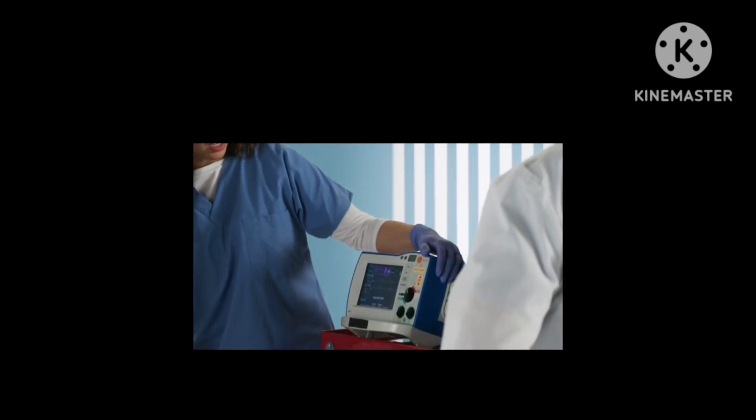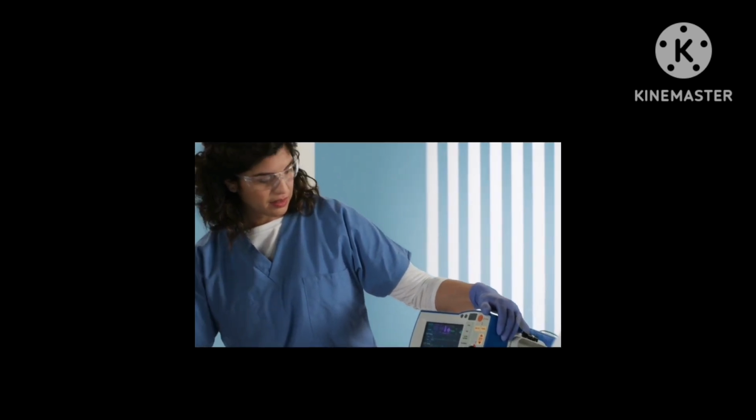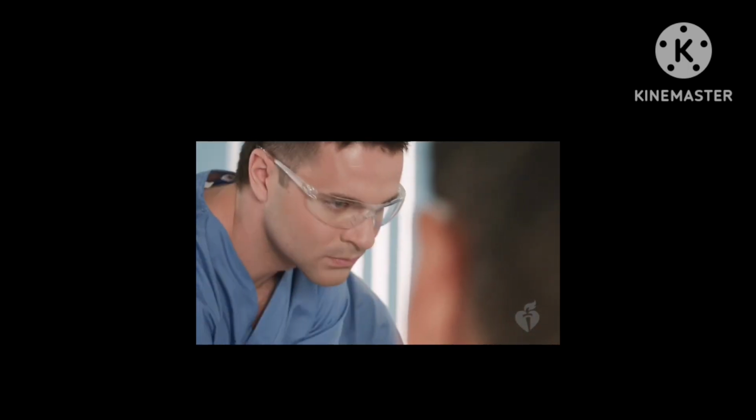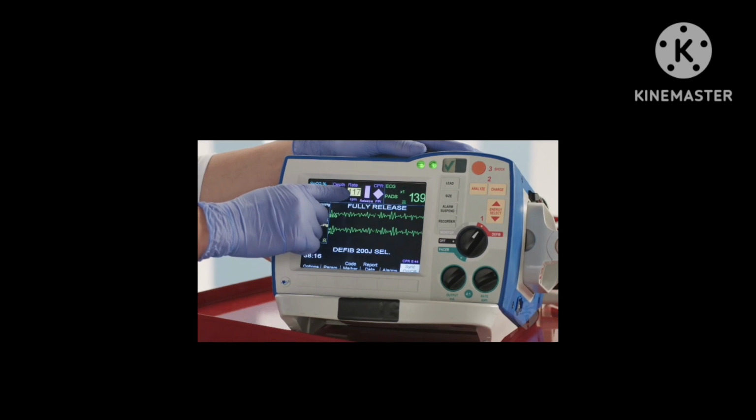CPR coaches should stand across from the compressor, always in the compressor's direct line of sight. CPR coaches should also stand next to the CPR feedback display, which is often located on the defibrillator, so that they can effortlessly redirect the compressor's attention to the data provided by the feedback device.